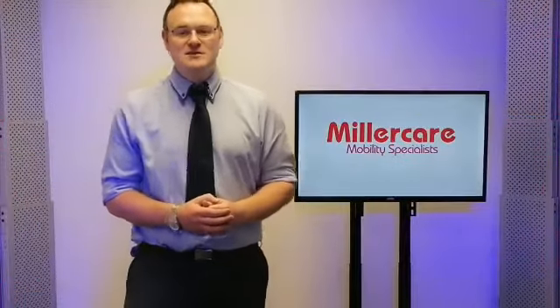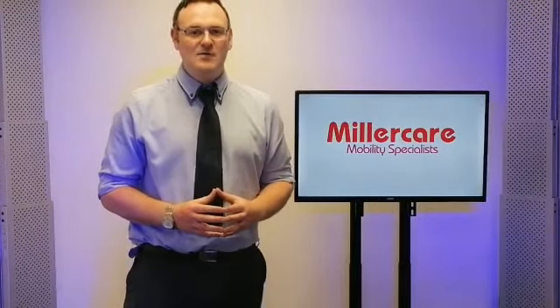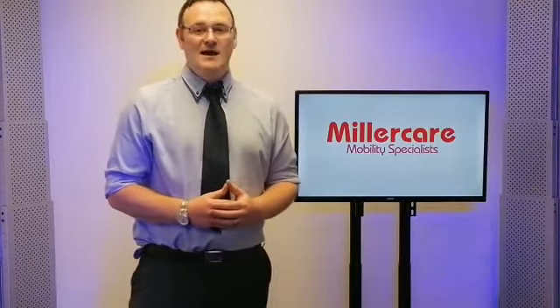Welcome to a Millercare product presentation. I'm your host Steve Starkey and today we're going to be looking at some products that help people when they're struggling with walking. We're going to touch on walking sticks, walking frames and trolleys.